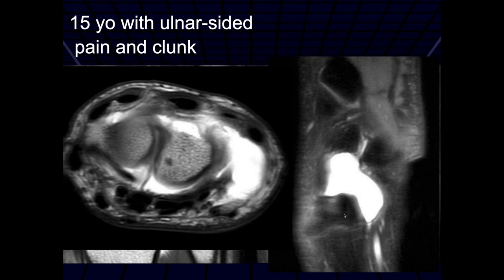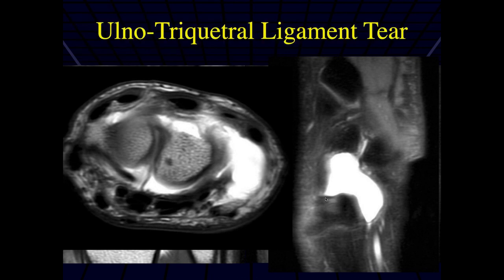The TFCC itself — I didn't see a discrete TFCC tear. That's right — the TFCC was okay. Here's the dorsal ulnar triquetral ligament right through here and we don't see it well. This was an ulnar triquetral ligament tear, which led to instability and the clunk that the patient had.